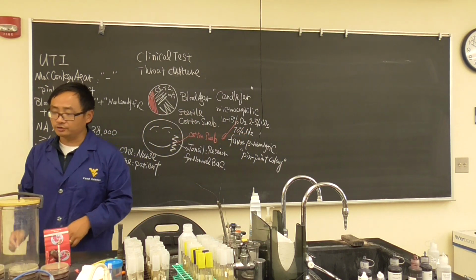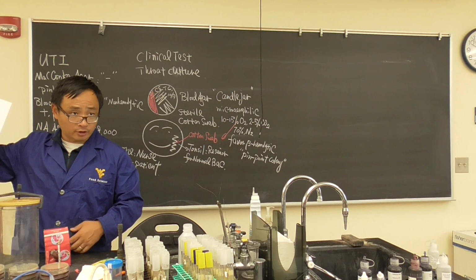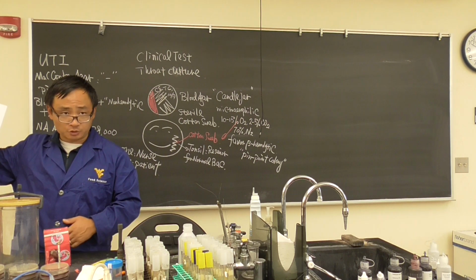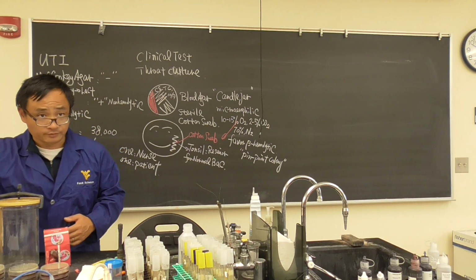And the detail is described in chapter 19. And this is the second lab report working with your bench partner. So today you get a throat culture, we'll grow it in the candle jar, and we will talk more on Thursday.